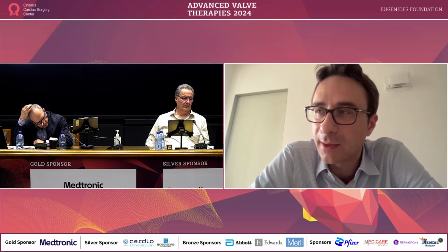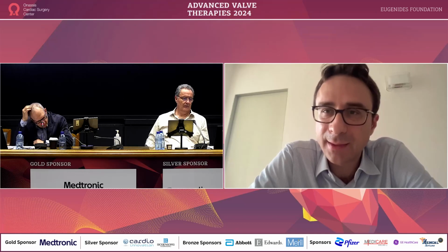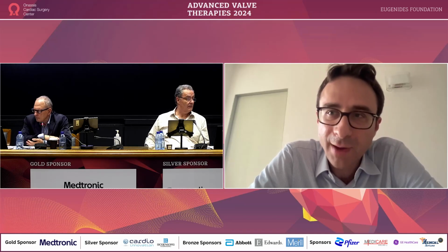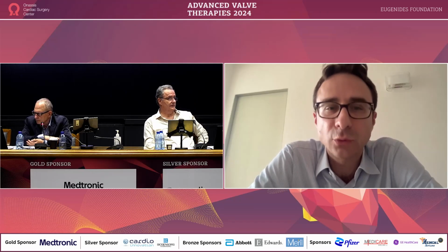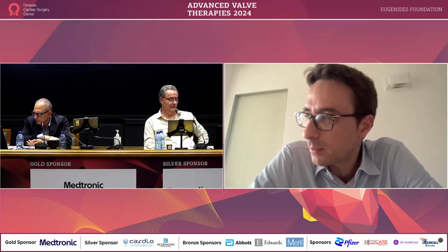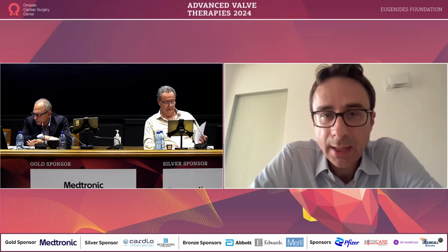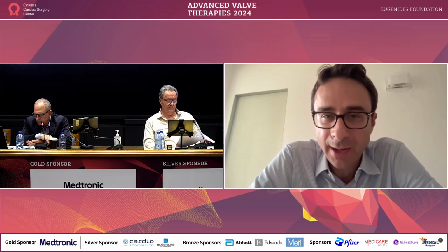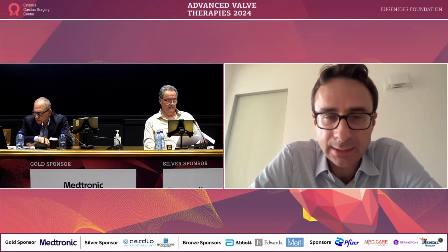What I learned from some complications is that sometimes, if you try to deploy the device a couple of times and it doesn't work because you are not completely aligned, it's better to do the puncture again. But when it's possible, in anatomies like the reverse chicken wing morphology I always prefer to do the pre-procedural CT, and then identify the right site for the puncture by analyzing the CT.